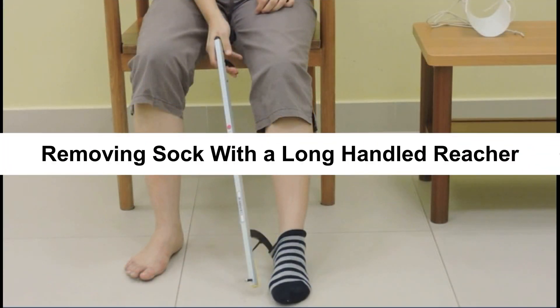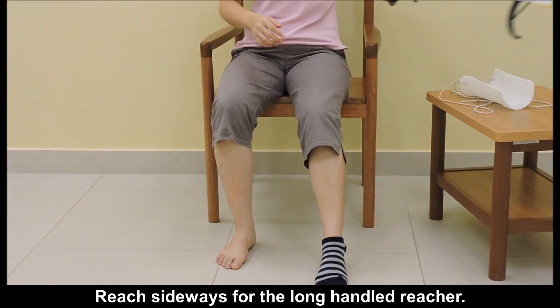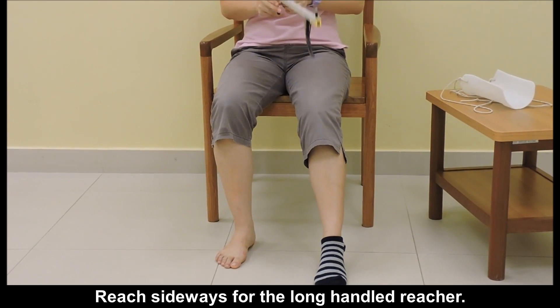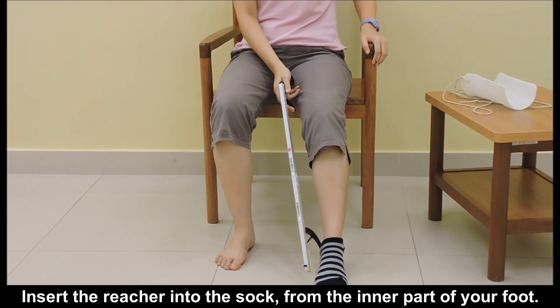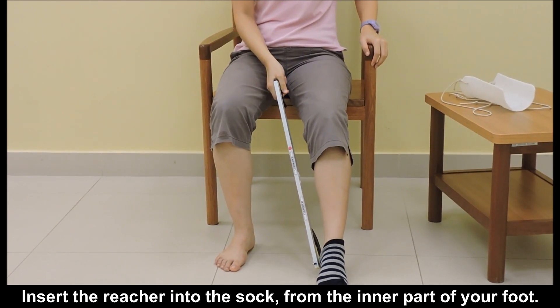Removing a sock with a long-handled reacher. Reach sideways for the long-handled reacher and insert the reacher into the sock from the inner part of your foot.